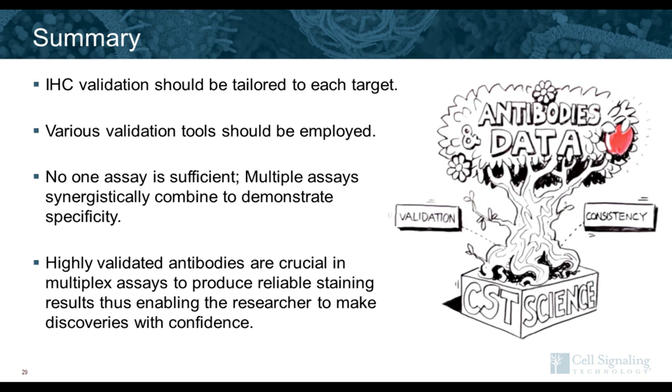I guess the first place to start would be to look for if the company selling the antibody recommends it for use in IHC in paraffin-embedded tissues. However, that doesn't necessarily mean it's going to be specific.